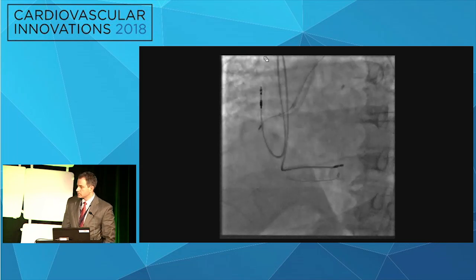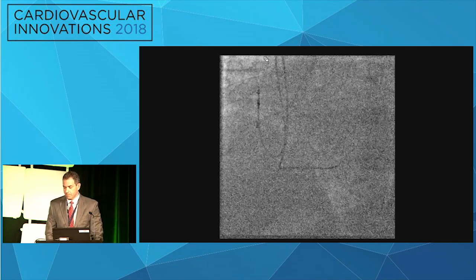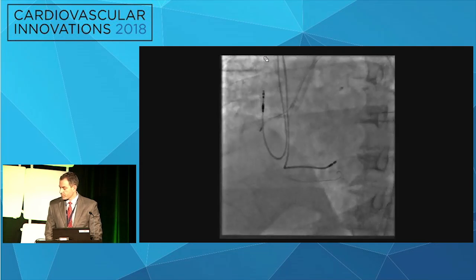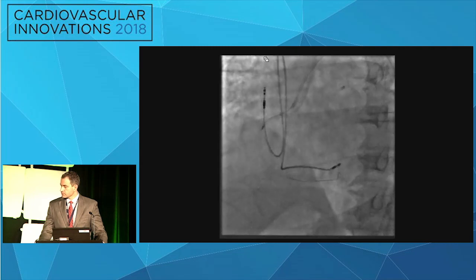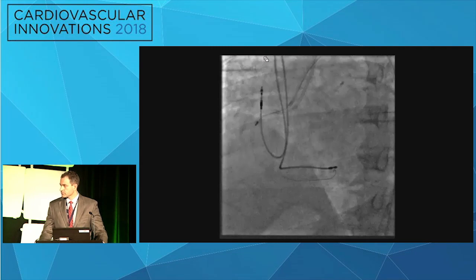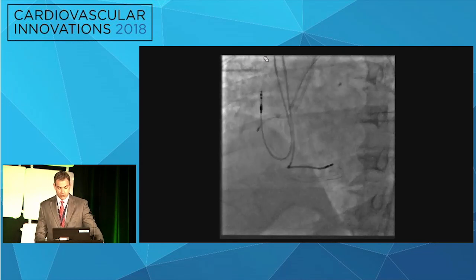Did you try, at this point, you can cut the wire. I know you're not supposed to do this. Cut the wire and get a guide liner over it, and try to get a guide liner around it, and then be able to pull. And we did that with a trap balloon, and really were able to get it out. Yeah, that's next, Dan. Actually, I'll show a slide on that and how to do it here shortly.